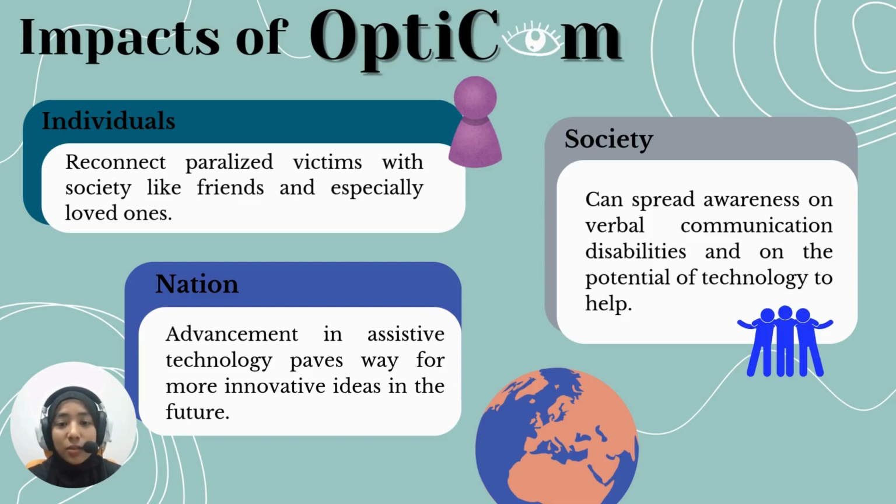At the basic individual scale, it is very impactful to paralyzed victims by helping them reconnect with society, like friends and especially loved ones. At a societal scale, OptiCom can prove to be able to spread awareness on verbally disabled victims despite communication being a basic human right. The impact OptiCom could have on the nation is by being proof of advancement of assistive technologies. It could inspire more ideas for other innovations within this area of technological application.